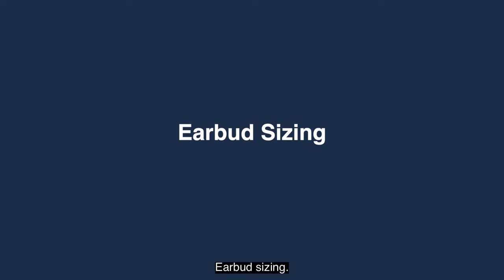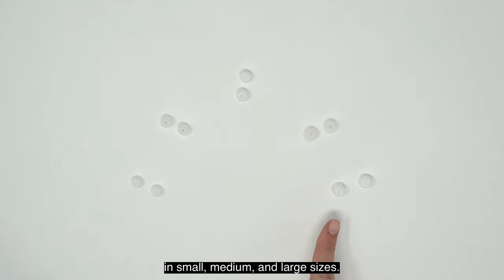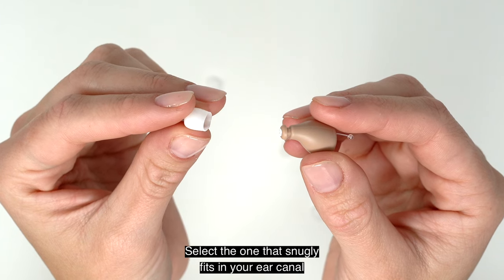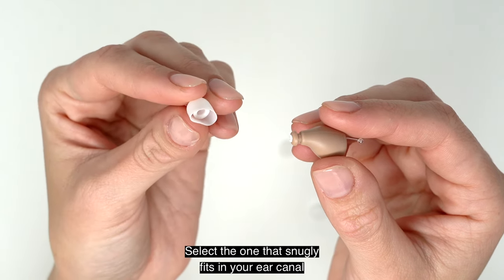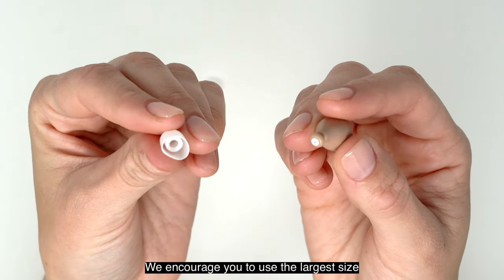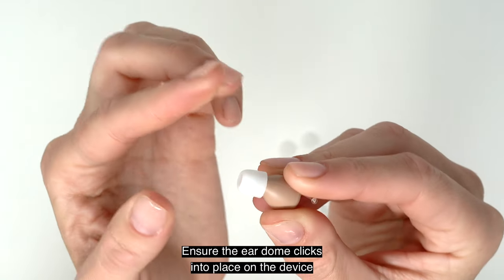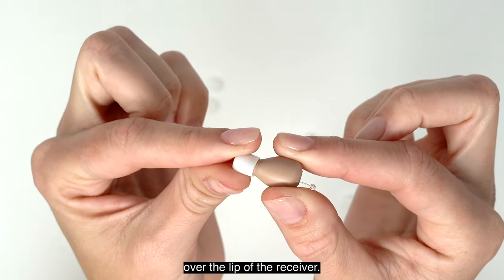Your Audion Atom 2 package includes a selection of ear domes in small, medium, and large sizes. Select the one that snugly fits in your ear canal to minimize feedback or whistling. We encourage you to use the largest size that provides a comfortable fit. Ensure the ear dome clicks into place on the device over the lip of the receiver.